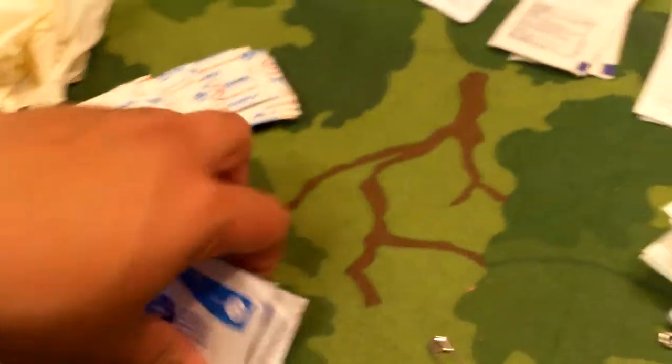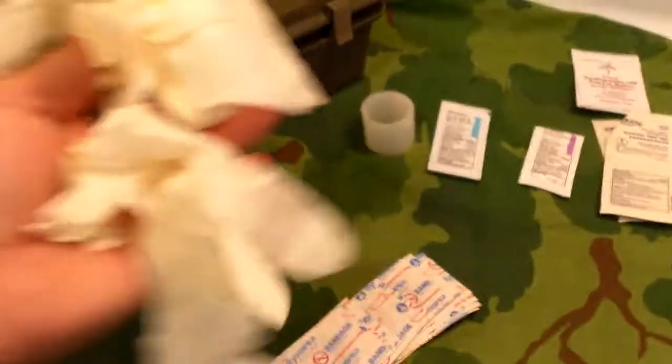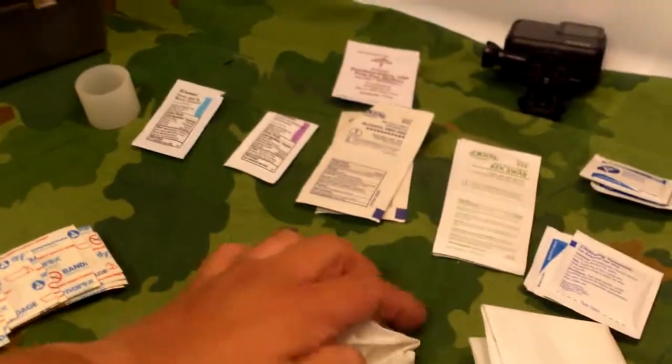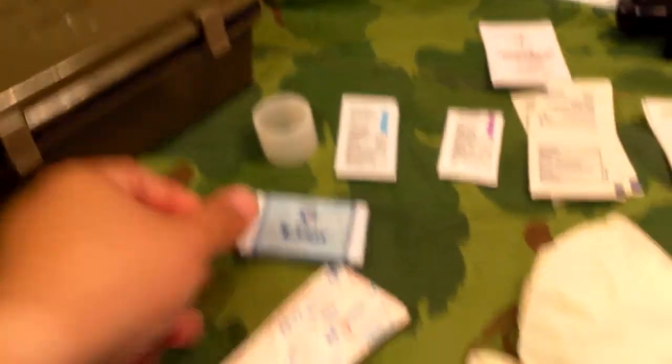Four antiseptic wipes — that's these ones. And four clean wipes — these ones here. One pair of latex gloves; those are going to have to be thrown out — I've got some nitrile ones I can replace them with. And hard soap, basically like what you get at hotels.